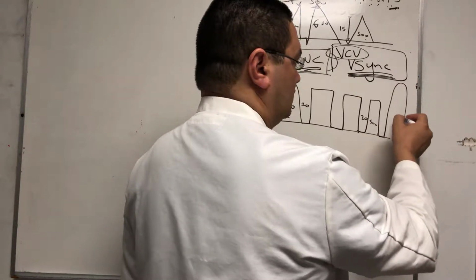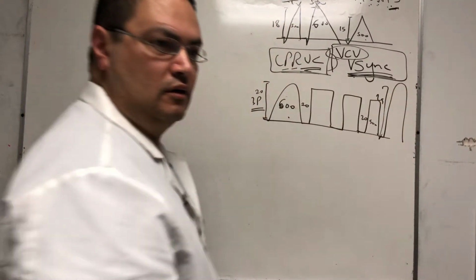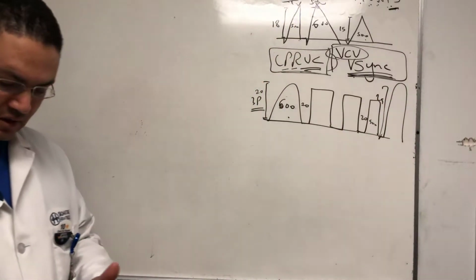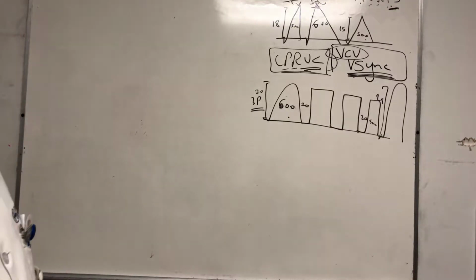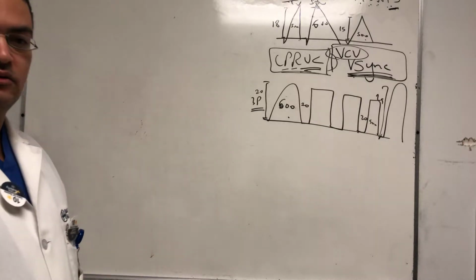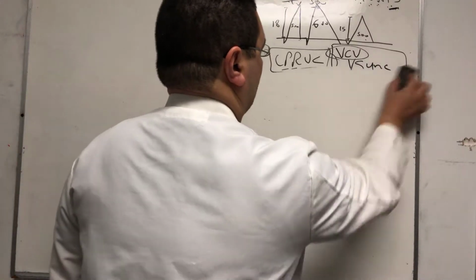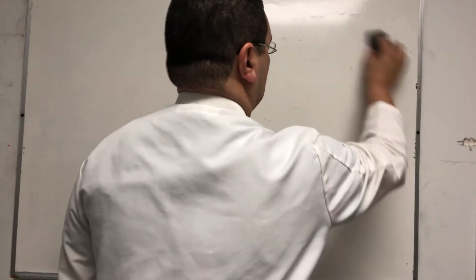Okay? And then when it retests, it'll say okay, it needs 25 now. We'll give him 25 from now on. And it keeps going up and down. Obviously, there's a pop-off valve that you can't go above. So you can't go above a certain level, whatever the level is, usually 35. Okay? So these are two advanced modes of ventilation. AVAPS, VSync or PRVC, similar to each other.